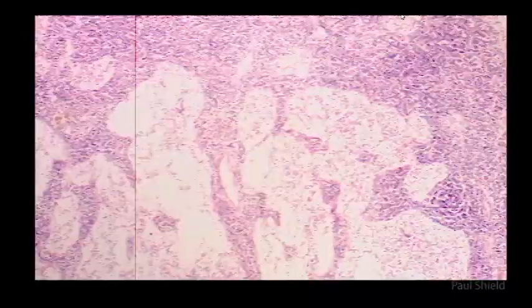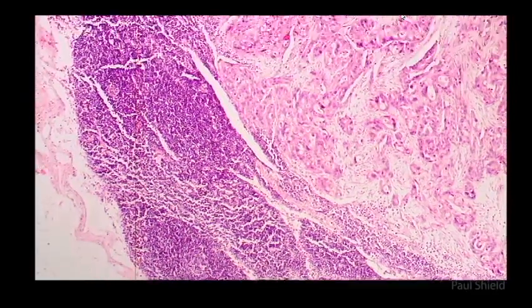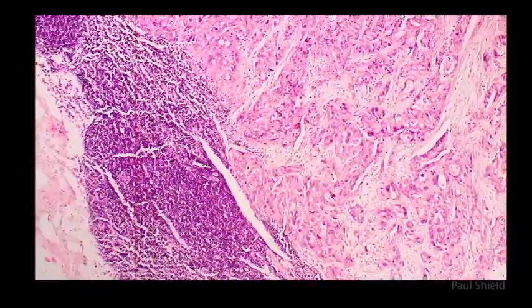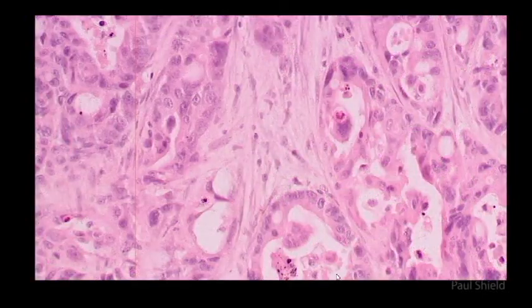And there's a third node just over here, and you can see it's quite different. So we have normal lymphoid material on the outside, and then effacing the architecture of the lymph node is this growth of tumour cells, which look almost exactly the same as the primary tumour. You can see a bit of glandular differentiation. So here they're lining up like gland cells around a lumen, and there is prominent nucleoli I'm pointing at, and cells arranged around like a basement membrane.